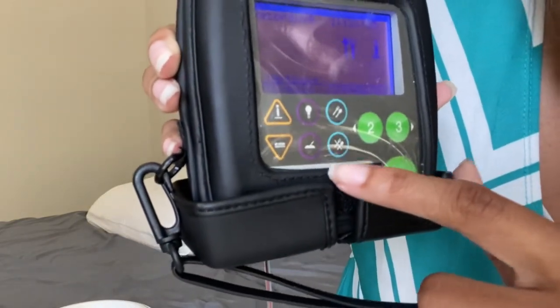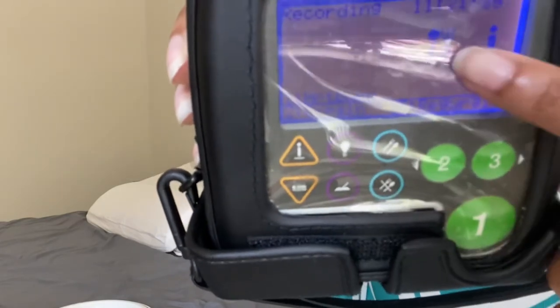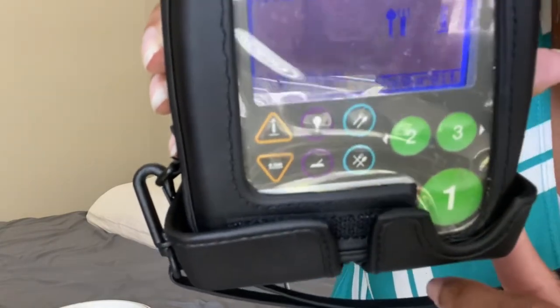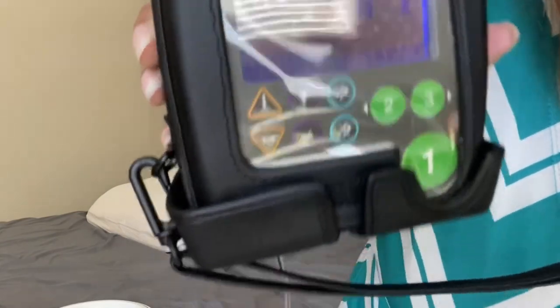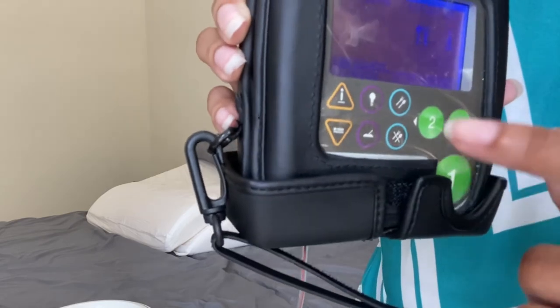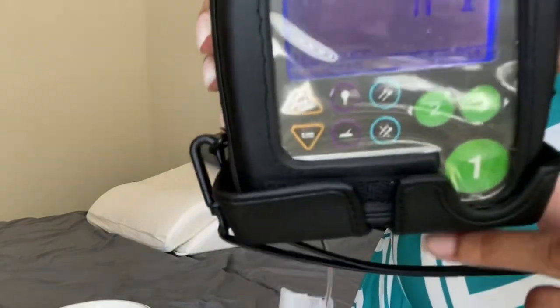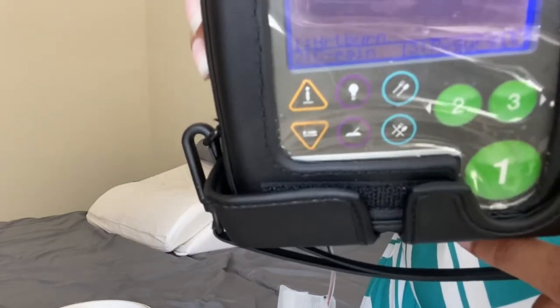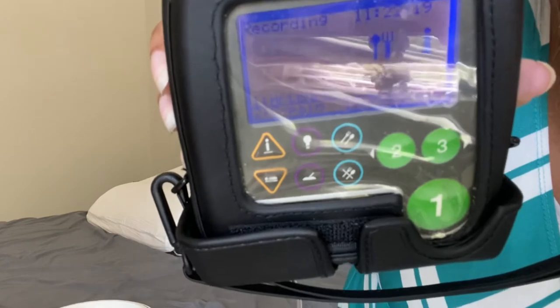When you stop eating, you would push here and it would change that signal, and you'll write down the time that you stop eating. On mine, for the 1, 2, and 3, they have heartburn, chest pain, or regurgitation. So if I notice any of those things, I would push 1, 2, or 3, of course.